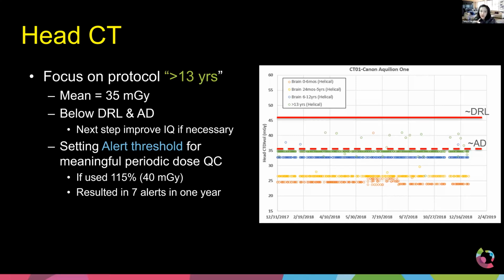So does it mean you recommend at least having two alert levels? The one is a really high or dangerous level that needs an immediate real-time alert. And the second level, we can review retrospectively, quarterly or something. So the answer is yes.